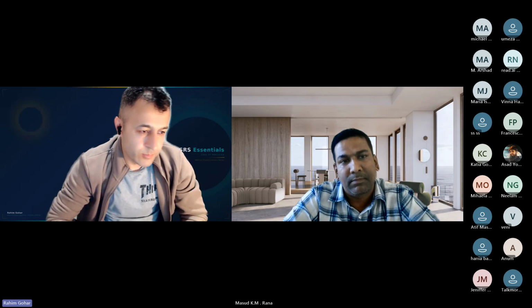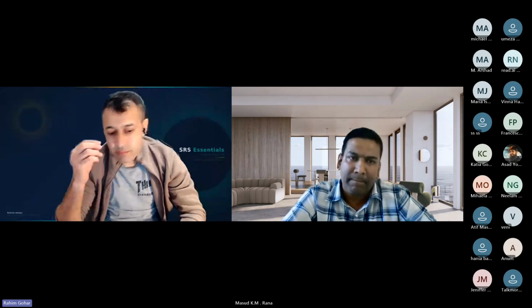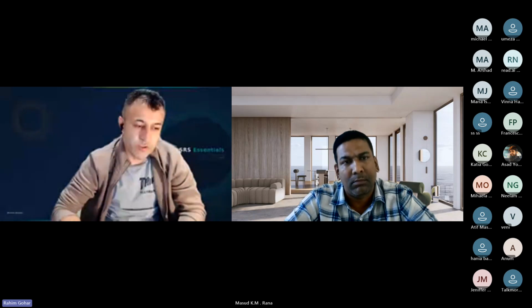Yeah, sure. Let me try to summarize as precisely as I can. Definitely, most of the patients come as referrals. Once the RO thinks that this is really a patient for SRS, the ROs arrange for the MRI scan under the same settings as we do the simulation.